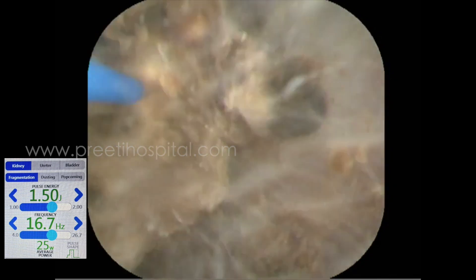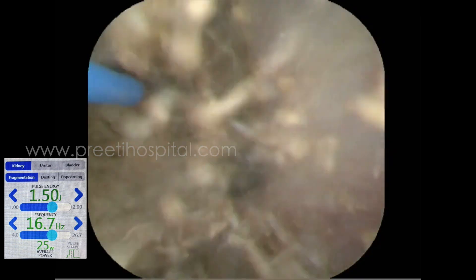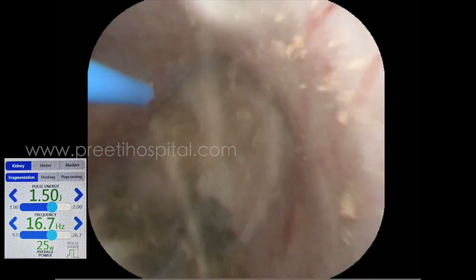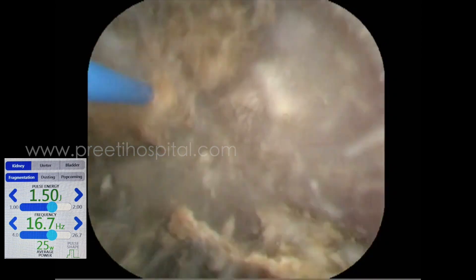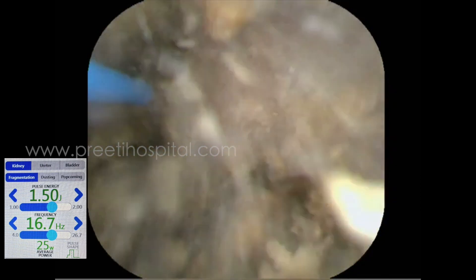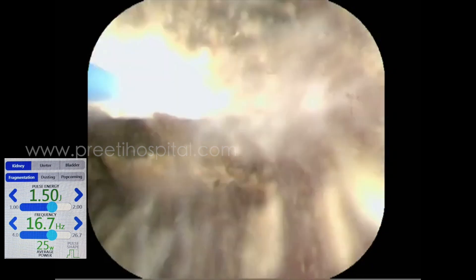The access sheath is only 25 centimeters, which I kept in the mid or lower ureter. I pushed this stone into the upper calyx purposefully and did pop dusting. I spent a good amount of time because I was not going to do fan suction. I am now used to fan suction, so I felt unhappy leaving all this powder.